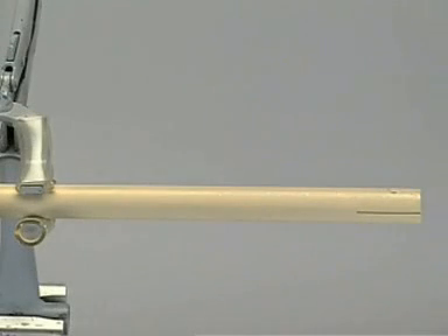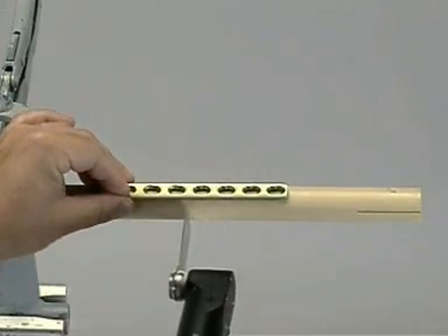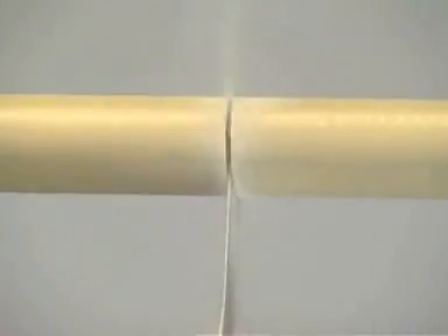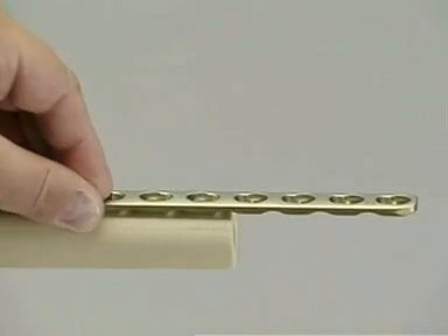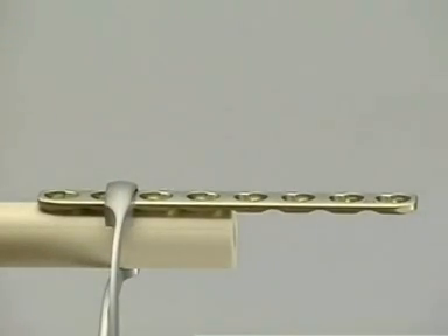To start the exercise, one end of the generic bone is fixed in the clamp. The eight-hole LCP is positioned on the intact bone, marking the site where the transverse osteotomy is to be done with the oscillating saw. The plate is placed and secured with bone-holding forceps to the bone fixed in the clamp so that the center of the plate lies over the osteotomy. The plate is now fixed in place with one screw.